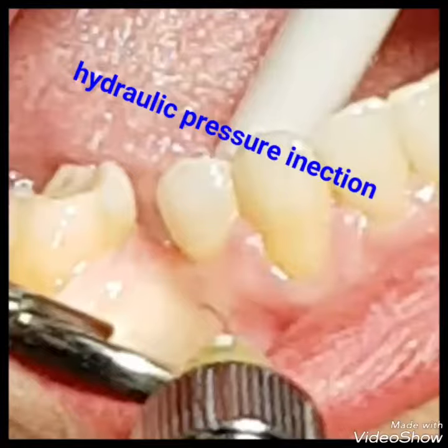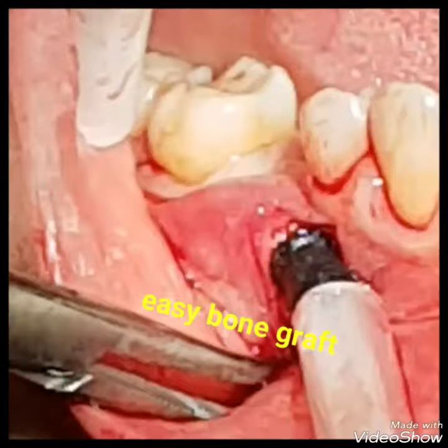As you can see, this is very minimal invasive and reduced patient morbidity and post-operative pain and swelling.